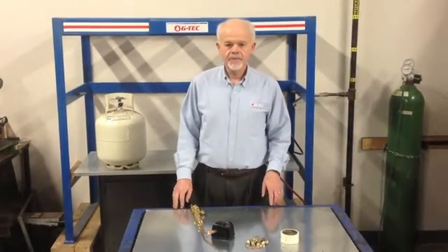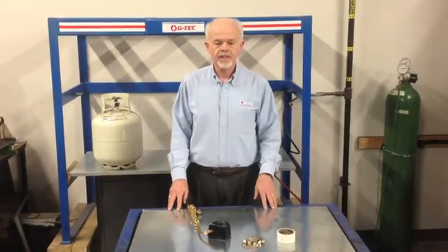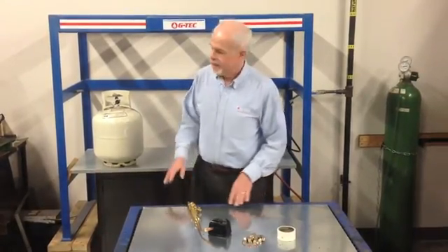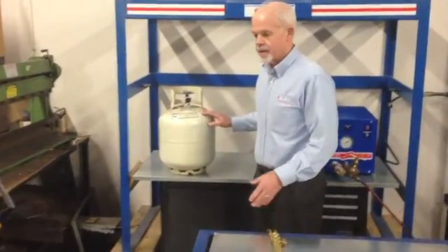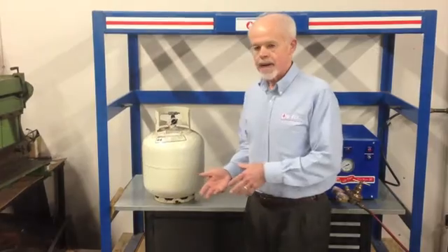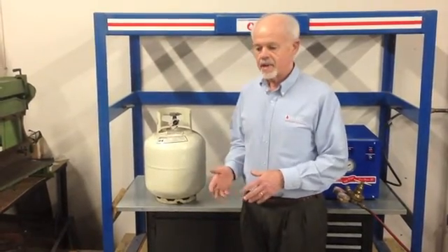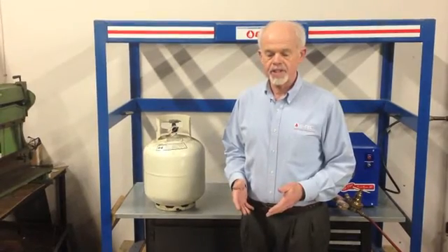Hi, I'm Ed Howard, and today I'd like to talk with you about the fuel gas that you use in your dental lab. Many dental labs have a tank of propane like this that they use for casting. Maybe a tank like this sits underneath your casting machine or next to it, or perhaps you have a tank of acetylene, but in any case you probably use a tank of fuel gas to run your torches.